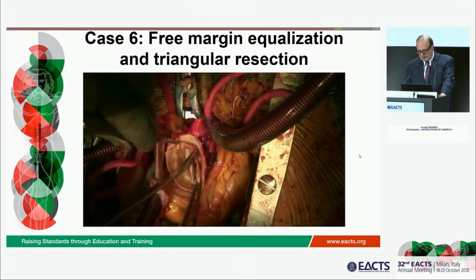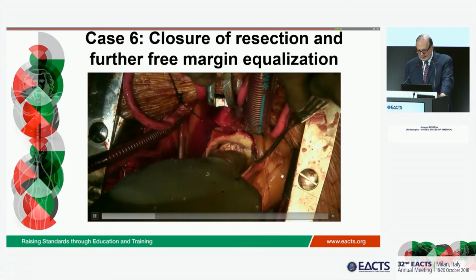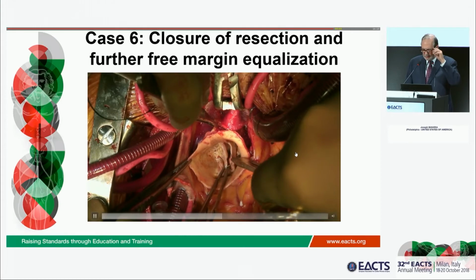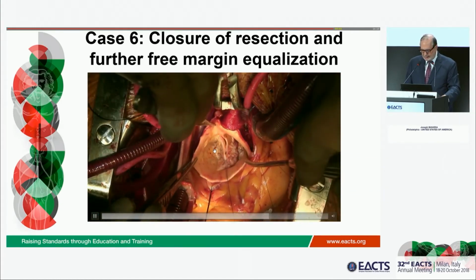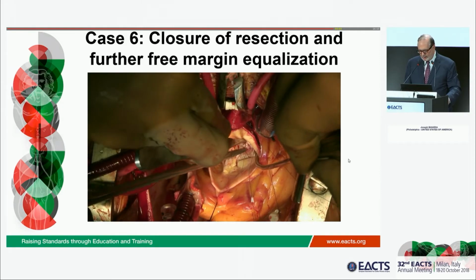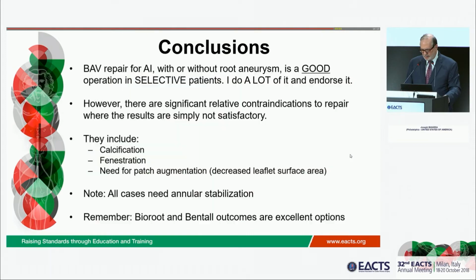We do that. We put these stitches in. It's almost the entire length. I finished the case, and I'm just looking at this, and I don't really like it. I would like to see what maybe Laurent would have done with this. But I decided that he's 71. I didn't think, here's a piece of calcium here. Even though we tried very hard to save this valve, I decided to abort. We decided not to do this case and put in a regular aortic valve.